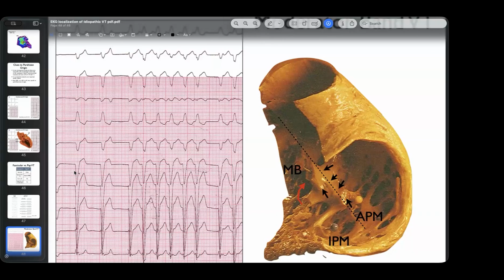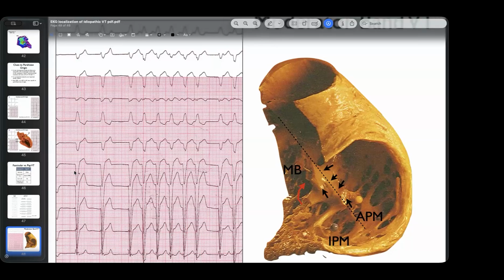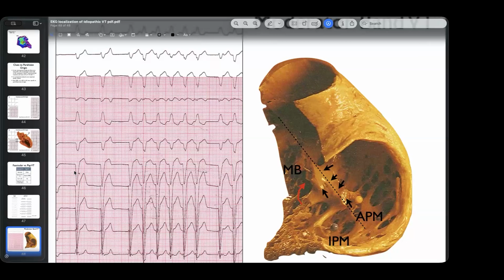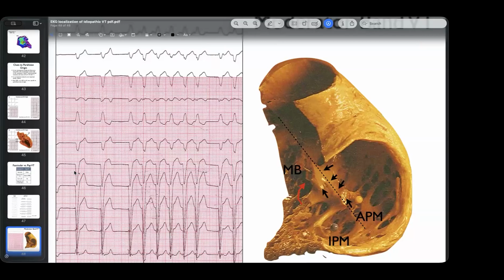And I'm seeing passive activation of the RVOT. So then I've got to go to the LVOT and see if there is earlier activation there. Now I see something that is 30, 35 pre-QRS. Now I'm convinced. So anytime you see a very wide area, it usually means it's passive secondary conduction. Okay. But if you go to the left side and it's late, what's the other option?